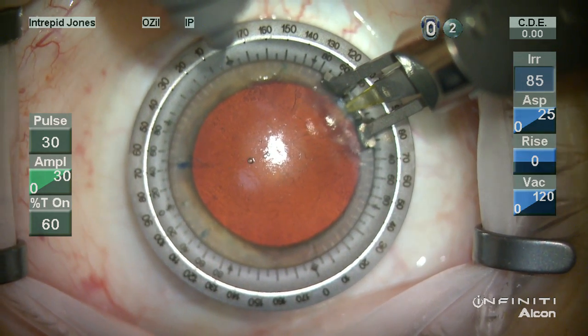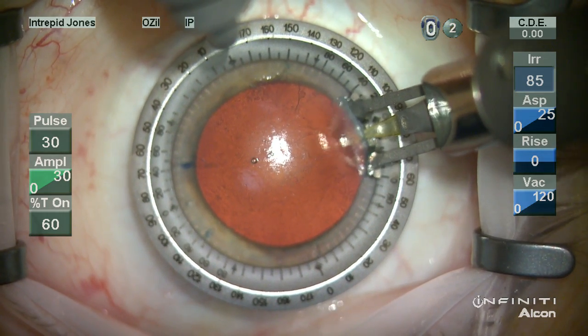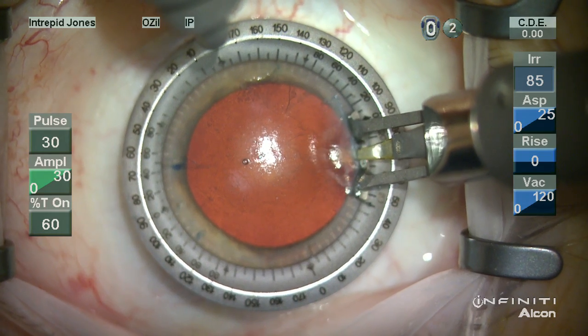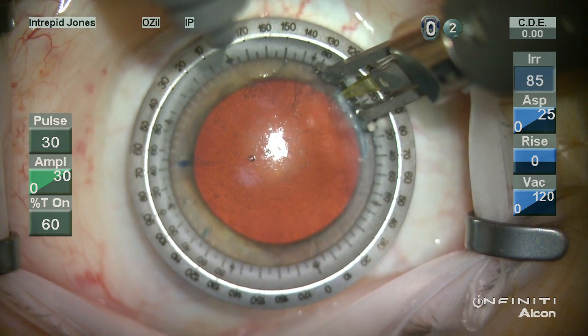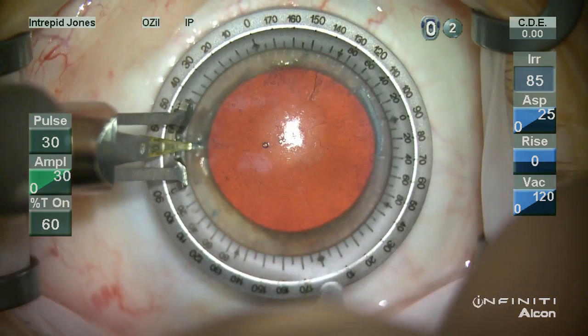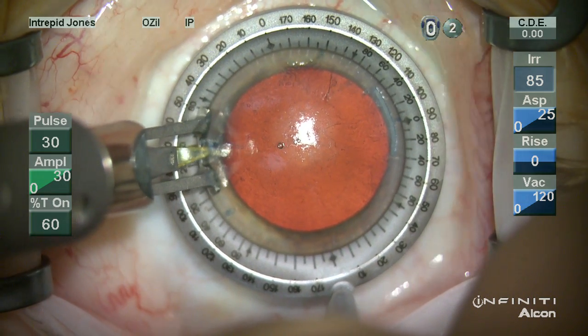The blade is then plunged into the corneal tissue at the mark. I like to incise towards me, so I'm dragging this blade towards me. If you have to do a little touch-up, go back in. Sometimes it's helpful to lift and reset down just to get a little bit extra depth and length.